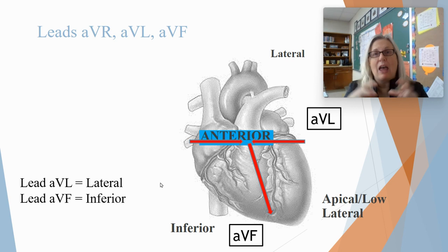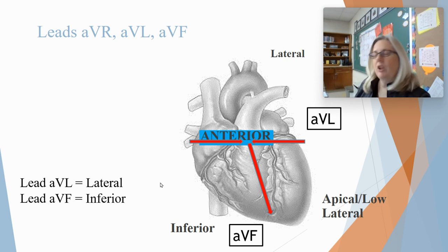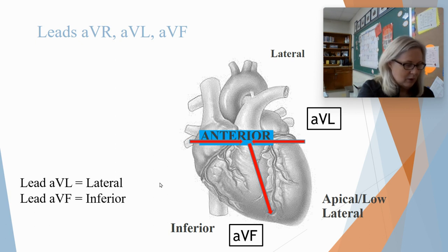So those can be grouped together on our EKG. I will probably be drawing that on there, and you can use your EKG as well. I know we drew a lot on EKG 1 for our heart axis. So I'm just going to maybe put this on EKG 2 just so I don't have a bunch of stuff messing it all up. But my 1 and AVL go together.